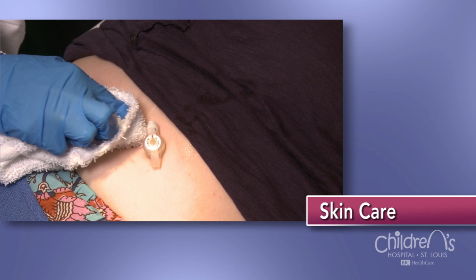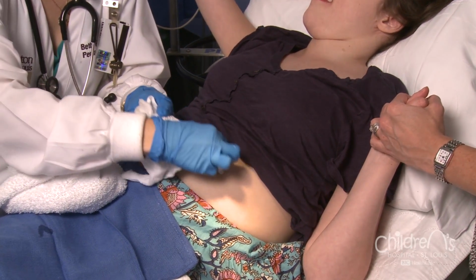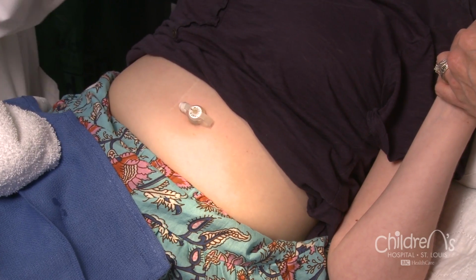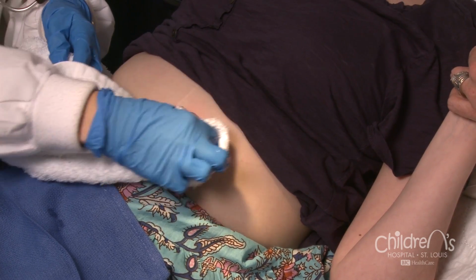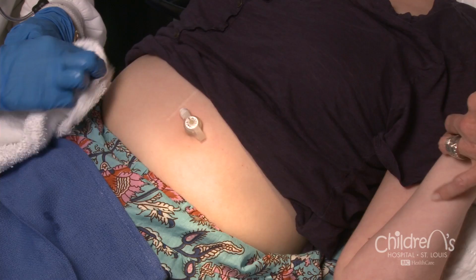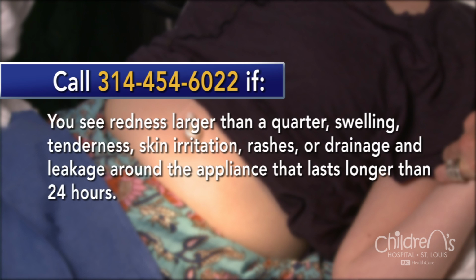As with any surgical site, it is important to keep the skin around the gastrostomy appliance clean. You should clean around your child's appliance with soap and water at least 3 times a week. Rinse the area well and then pat dry. Check the site daily for redness larger than the size of a quarter, swelling, tenderness, skin irritation, rashes, or drainage and leakage around the gastrostomy appliance. If any of these occur and last more than 24 hours, please call the surgery office.